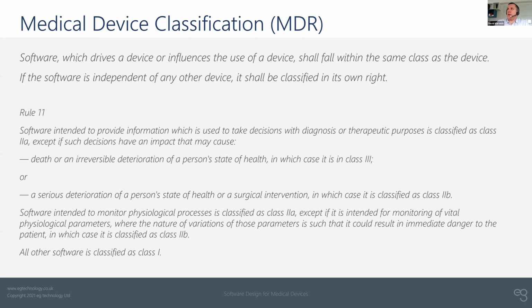Your software is not going to say, I'm assuming, update the medication that they are taking by 10 milligrams. It's going to be providing supporting evidence saying they are, I don't know, jiggling about a bit less, or their activity profile is like this, in conjunction with the dose you've been taking, maybe some other measurements, some other observations, the patient's feedback, and your clinical experience. You're going to decide the treatment pathway.